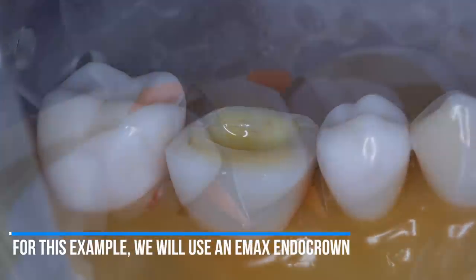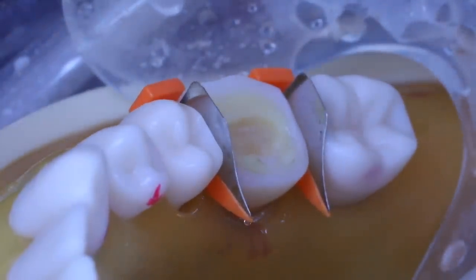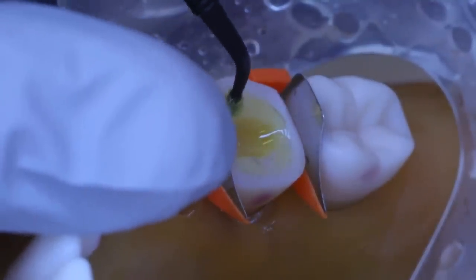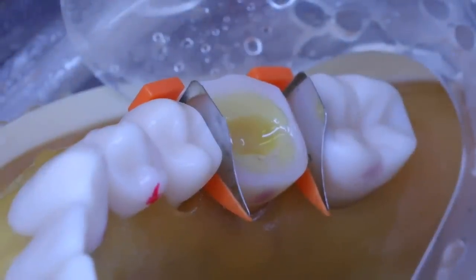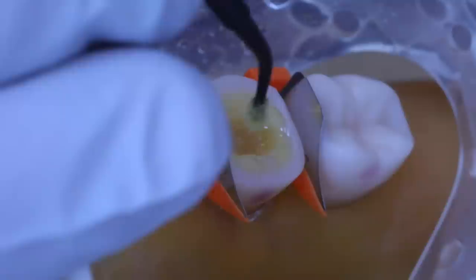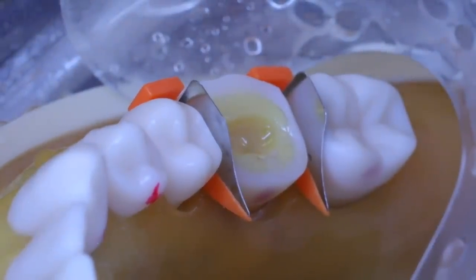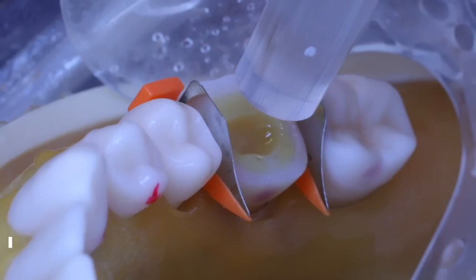After you prep the tooth for your Emax crown, we do immediate dentin sealing. Take phosphoric acid, etch the enamel and dentin of that preparation for 15 seconds, rinse it off, and dry gently — you don't want to over-dry and collapse the collagen fibers. Next, apply Scotch Bond Universal to the dentin only. Using a microbrush, apply it very thinly so it doesn't smother the preparation. Then light cure for about 20 seconds.